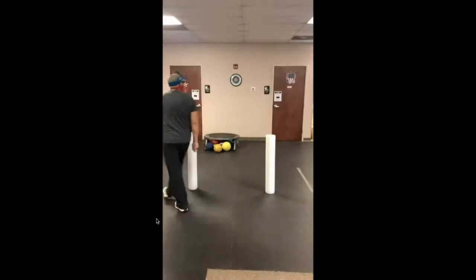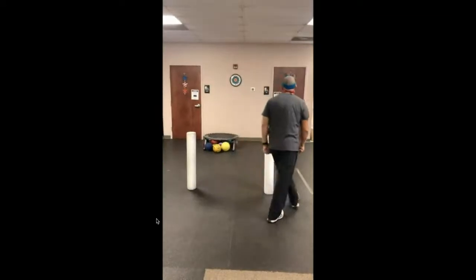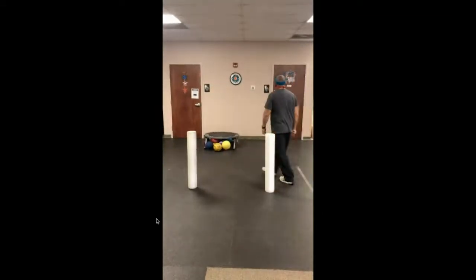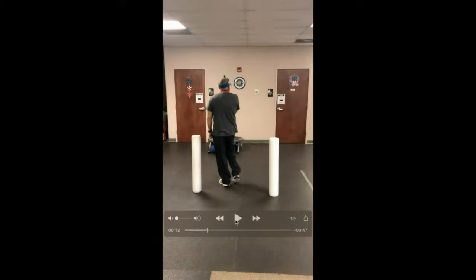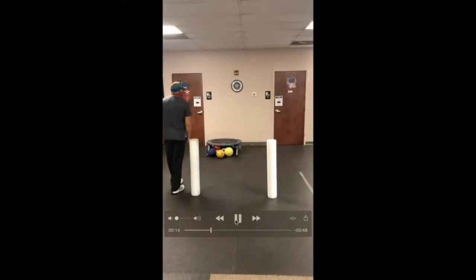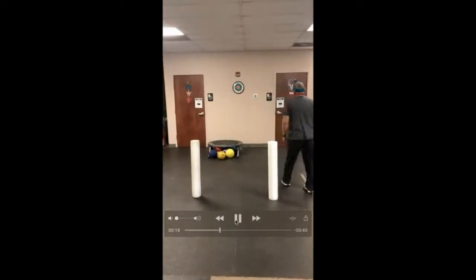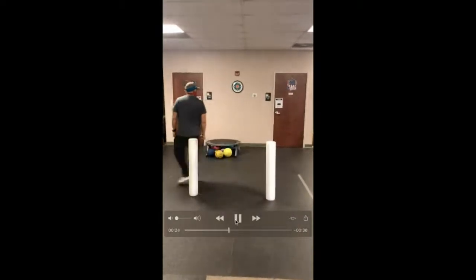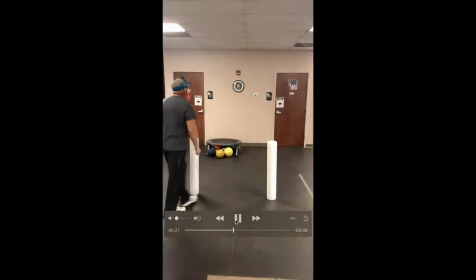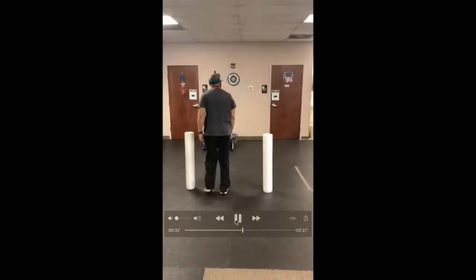So versus just doing a particular activity, looking at where their deficits are can really be enhanced with the visual feedback from the motion guidance device. If we look at that again, kind of midway through, he can go around this side. He does pretty well going through. When he's going around in front and just backing up, he does pretty well. But as soon as we make him reverse, you can see where the deficit pops in of what he doesn't like to do. He's going to stop right there and reverse it. And he has to back up this time.